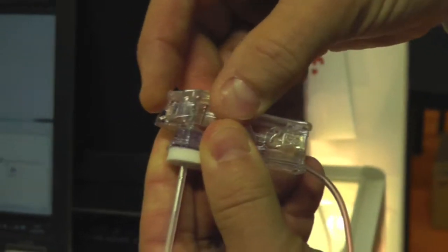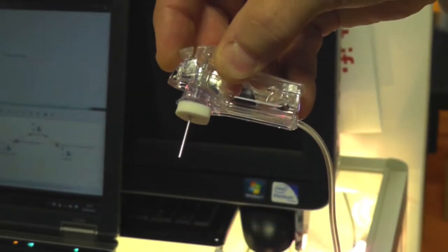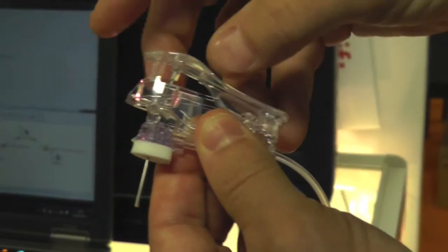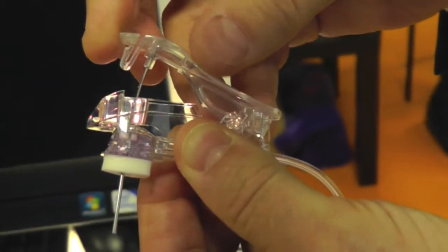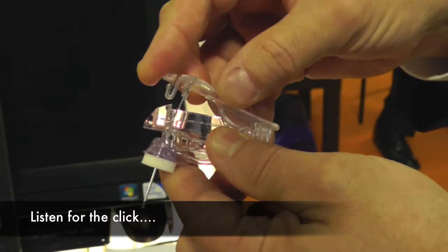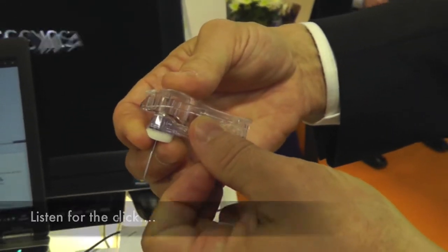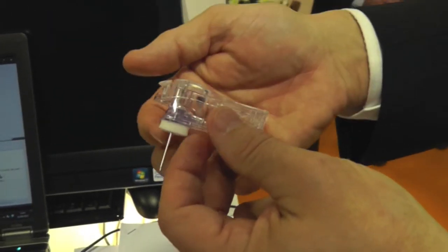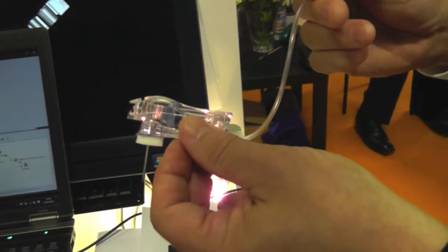As you can see here, this device allows you to have the needle for the port, and the needle itself has in it another wire, and what we're trying to do is to make sure that the patient can insert the needle, drive the wire down in. And I'm going to snap this now, and you can hear the click. And once that's snapped, we know that the penetration is correct, we know that the adhesive is in the right place, and we know that we have a good connection then to the wire.